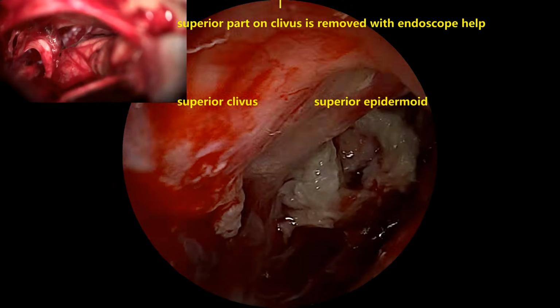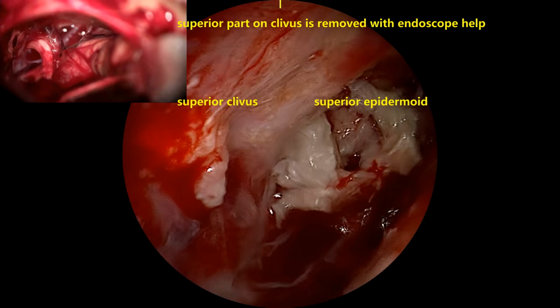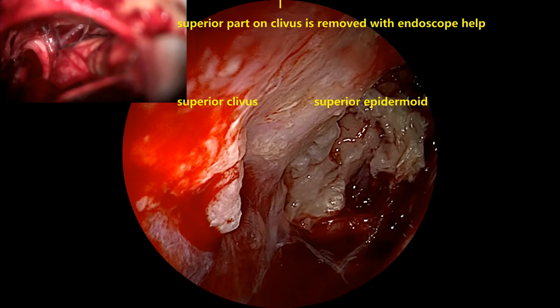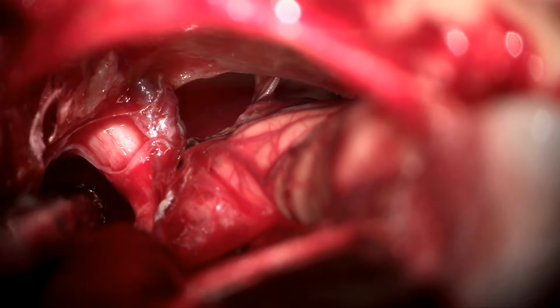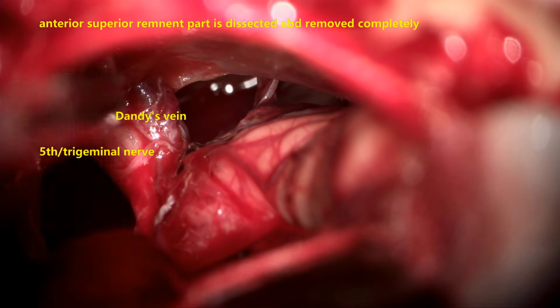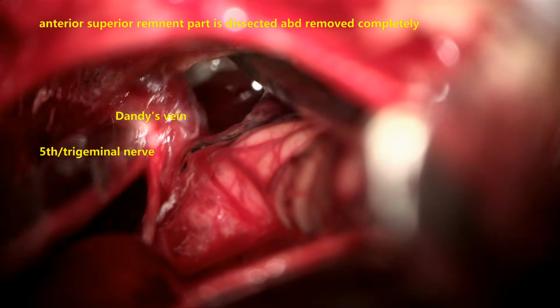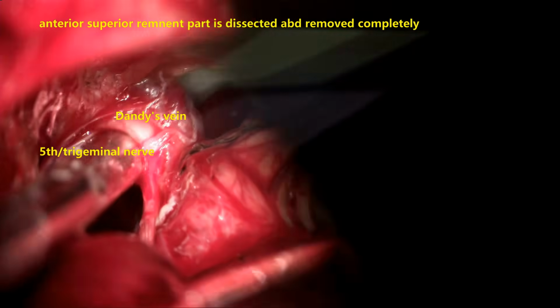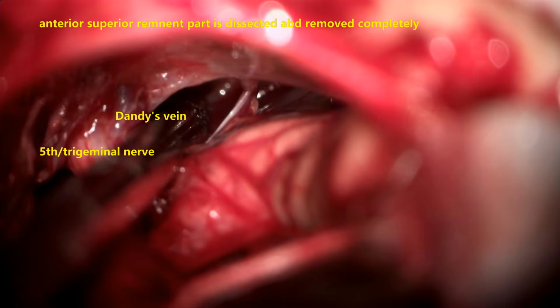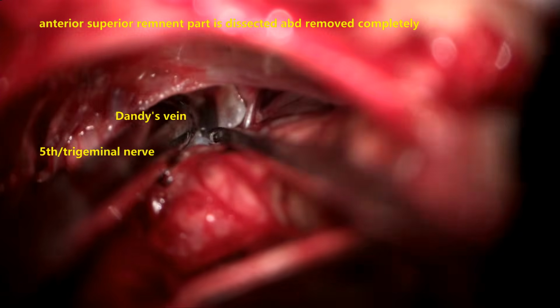Now you can see that lesion, superior part of the tumor, is separated and brought down with the endoscope assisted dissection. Now that part also is removed. Now you can see the one which was separated by endoscope brings down, and through the microscope it is taken out. Endoscope and microscope in tandem is of utmost importance in dissecting these cases. Posterior and anterior part of the lesion is removed.